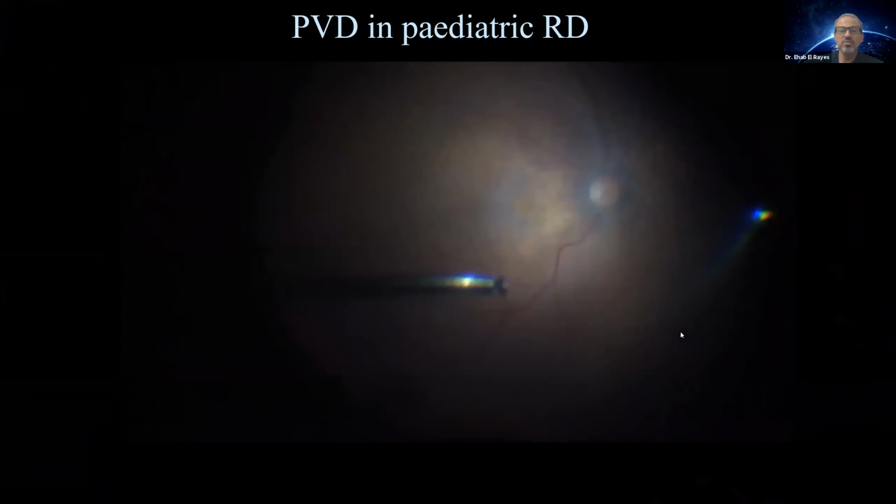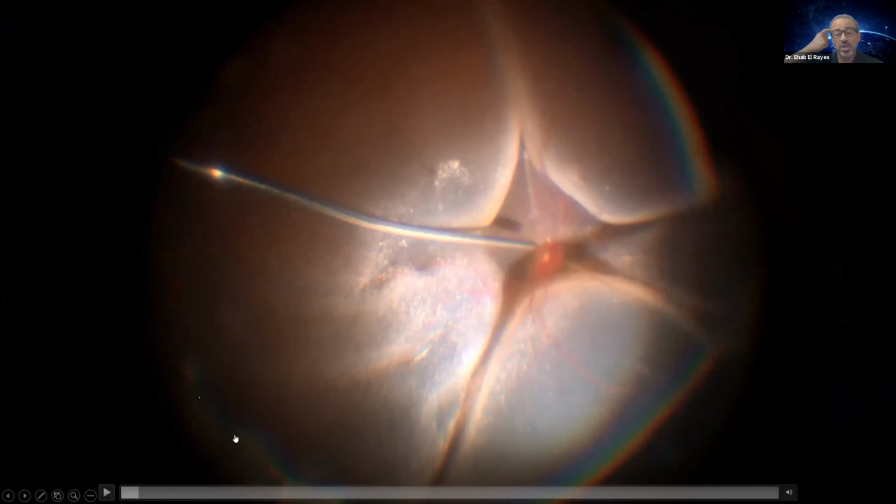So while doing PVD, it's very important to do it slowly in pediatric age group. And sometimes I resort to do it mechanically. The hyaloid is sometimes too adherent to the retinal surface to pop off by itself just by suction.